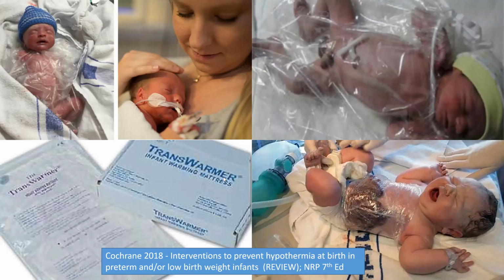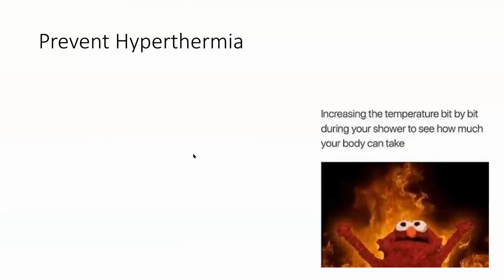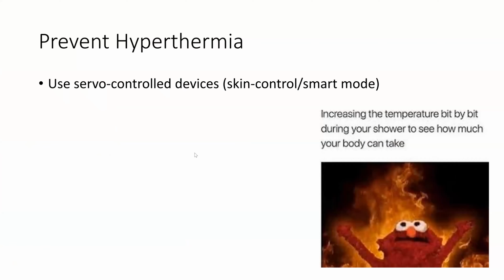So how do we move forward to this next generation? The other thing I want to say about hyperthermia is, of course, using servo control. Back in the day, we used to set that air temp and we didn't really have servo. We didn't have that skin control or those smart modes that would then titrate the temperatures up and temperatures down really nicely.